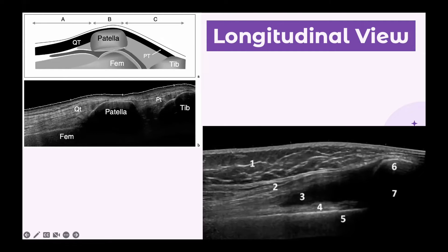Underneath the quadriceps tendon we can see the femur, and then below it we can see the patella and then the patellar tendon. Down here is the tibia. In this image, we can see an anechoic area between the quadriceps and the femur, which could indicate an effusion. Other parts of this ultrasound scan include subcutaneous fat, the pre-femoral fat pad, and over here is the patella with its acoustic shadow.